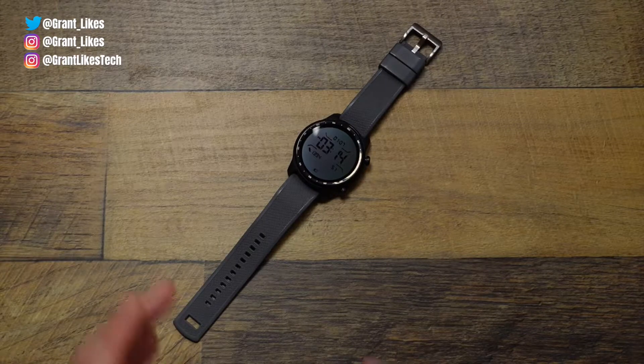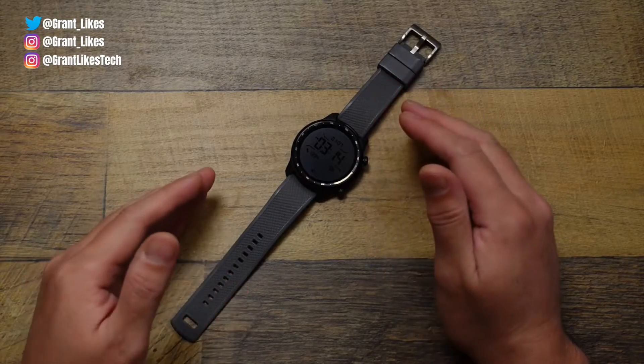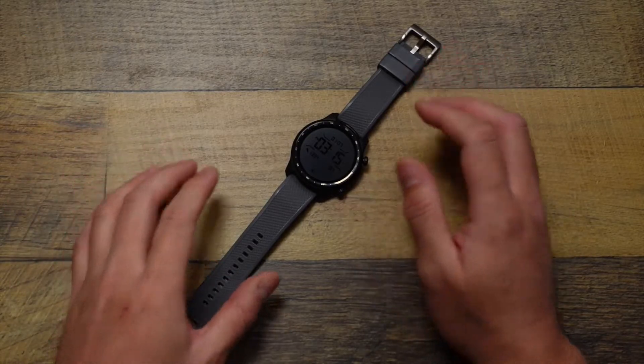Hoslin Grant here, welcome back to the channel. One of the new features on the TicWatch Pro 3 Ultra is being able to monitor for irregular heartbeats and atrial fibrillation detection, and that's not on by default.